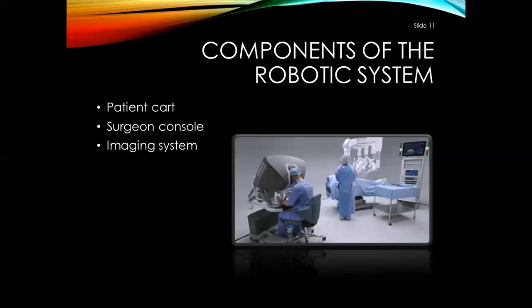Okay. And just so you understand, in robotic surgery, the surgeon is not scrubbed, as you can see here. He sits at the console and manipulates the instruments. The console is placed outside the sterile field, but close enough for effective communication between the surgeon and other team members. So rooms with robots are usually dedicated for the robots. These consoles are put where it's convenient for the surgeon and the rest of the team.